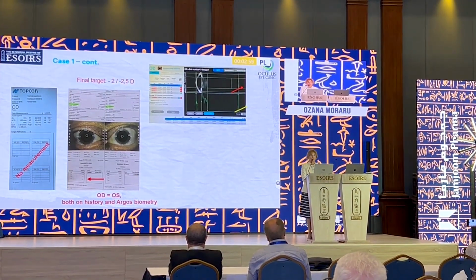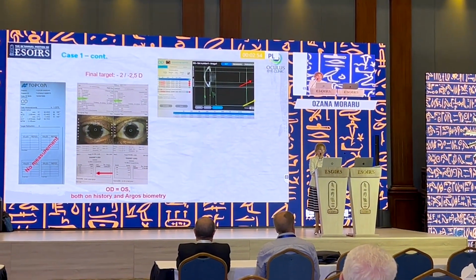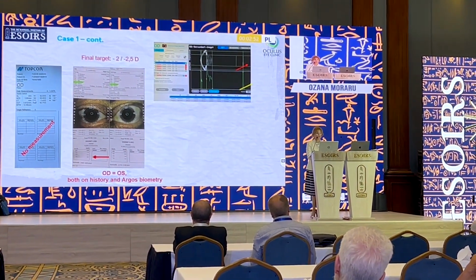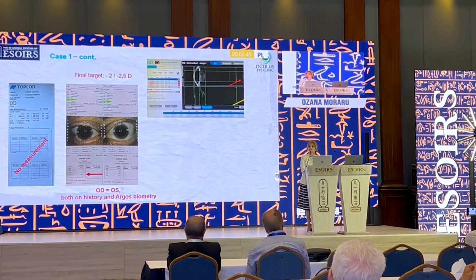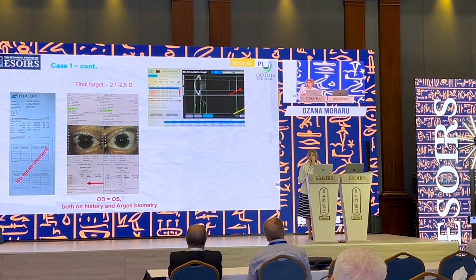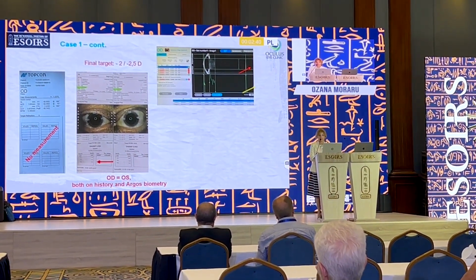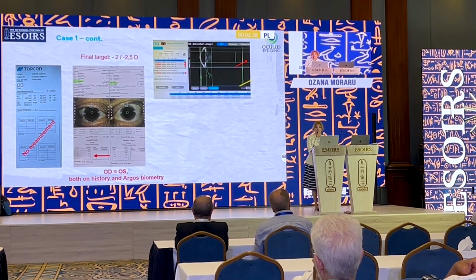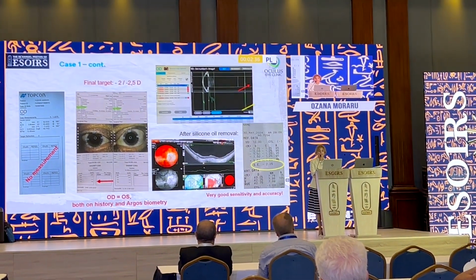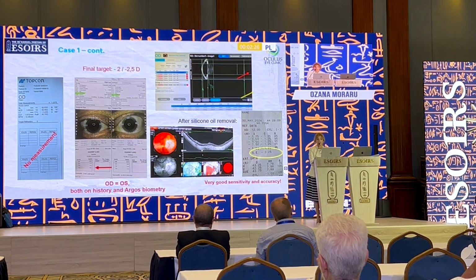First of all, let's see, Topcon didn't give us any result. Argos gave us results for both eyes, and it proved to be quite accurate, at least in terms of similarity with the other eye. We knew from the history that the eyes were equal in terms of refraction, and indeed we obtained with Argos minus 7, so similar results for both eyes. We were more trustful in this. And indeed, we performed this combined procedure. We removed the silicone, and this is what he left with, minus 2.25, so very good sensitivity and accuracy.